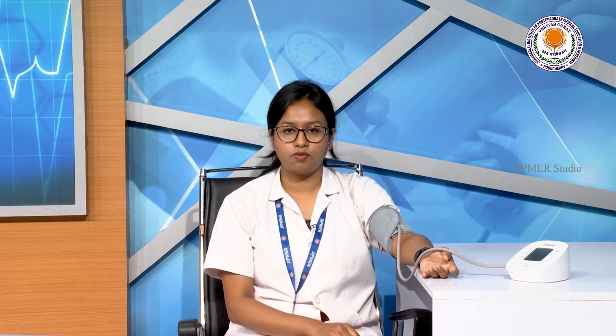Take your blood pressure by pressing the start button on the monitor. Verify that the connector hose between the cuff and the monitor is not kinked, because kinking prevents proper inflation and deflation of the cuff. You will feel the cuff getting inflated. Do not speak or move while the reading is being taken.